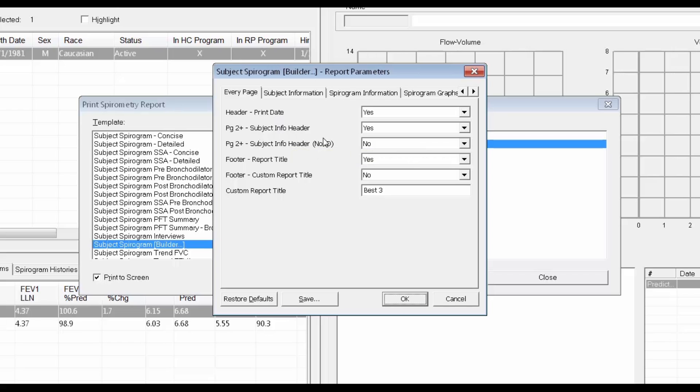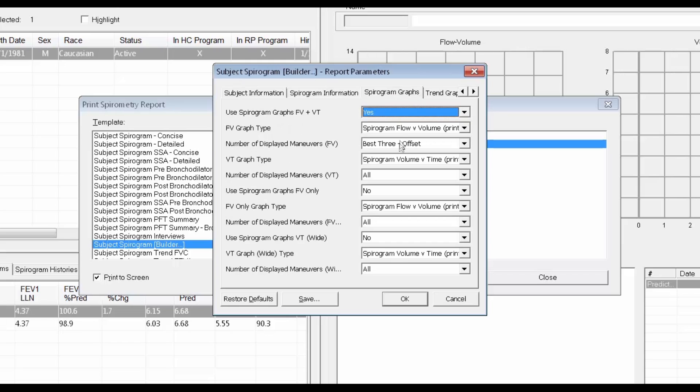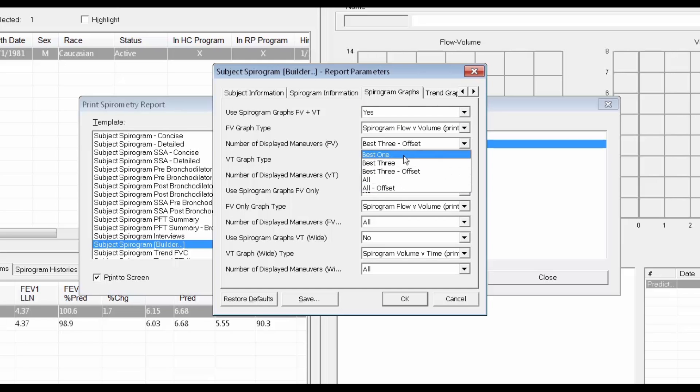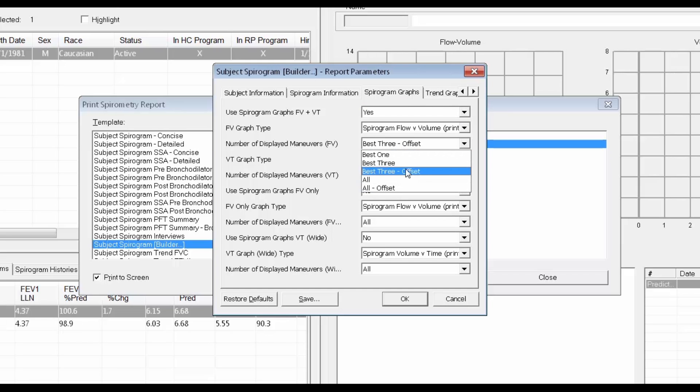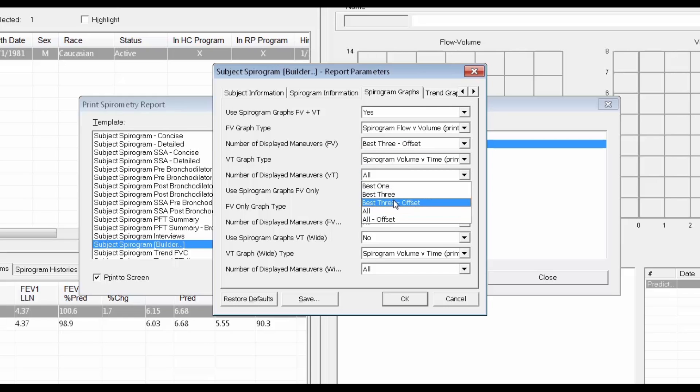We'll use the Report Builder feature to choose our graph options. In the Report Builder, we can build up the report we want from predefined subsections. Let's choose the header in a Standard Body section, and here are the graphs that are available. I'll choose Best 3 Offsets, and for the sake of an example, I'll also choose the Standard Overlay Graph with All.